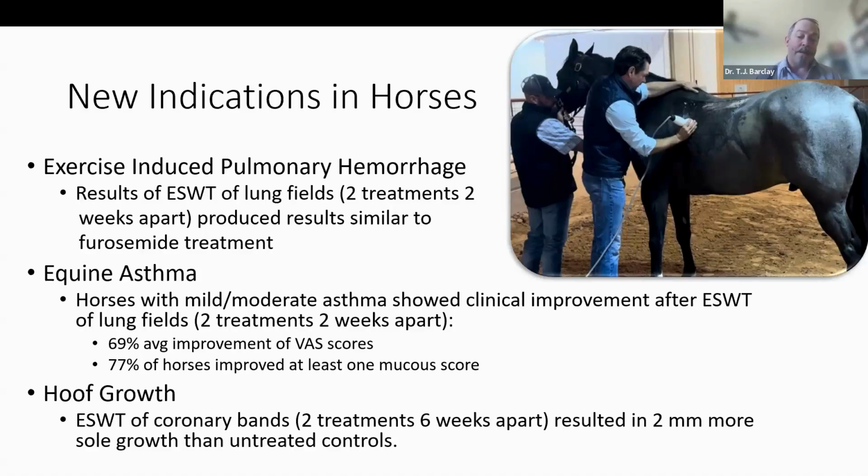So based on that, it does seem that shockwave is safe to perform on lungs. And having that information in hand, there was a study done looking at EIPH in barrel racing horses in Texas, over the course of a full year.